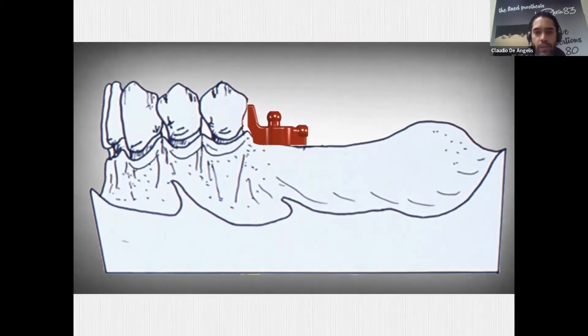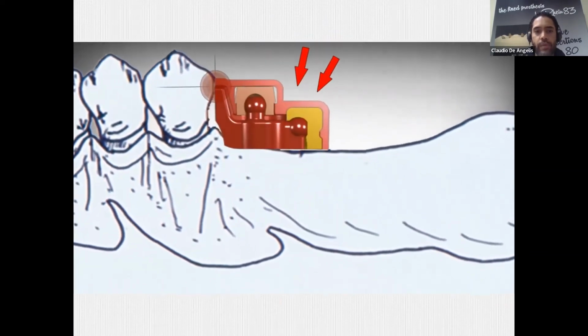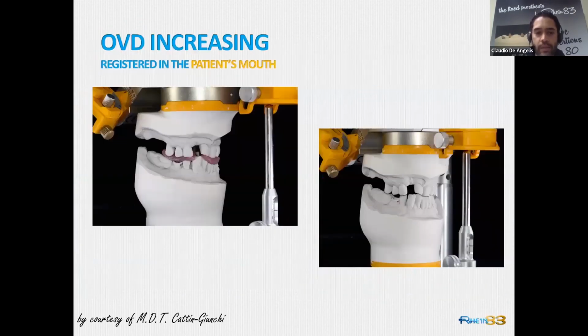Remember always to respect the geometries. Again, in this video, remember to respect the fulcrum area. So let's see a case with the two castable attachments.